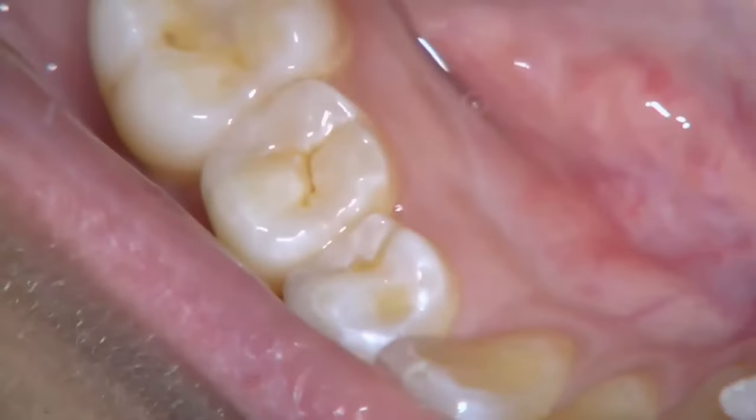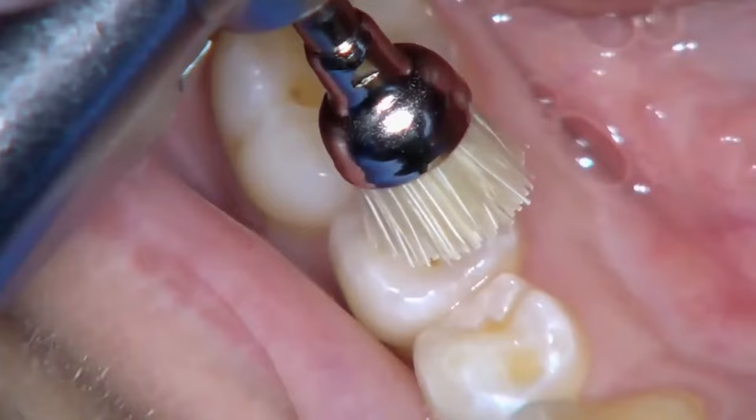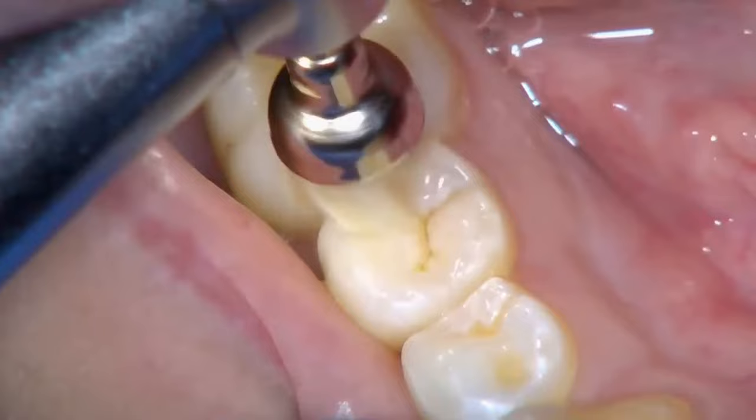In this video, we'll see the steps in the pit and fissure sealant application. First, clean and dry the tooth using a slow speed handpiece and a profi cup or brush. If required, pumice slurry may also be used.